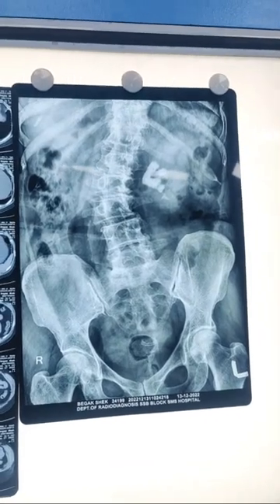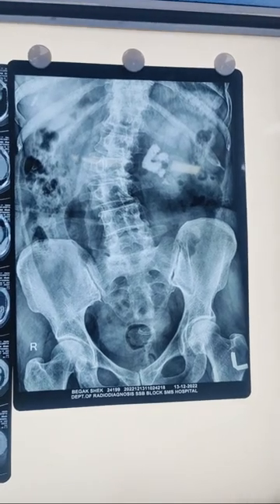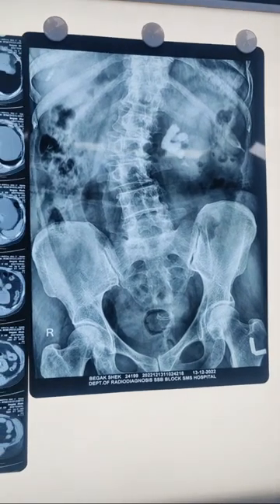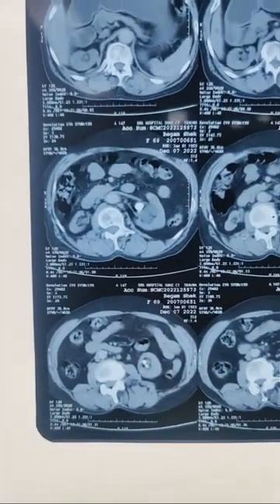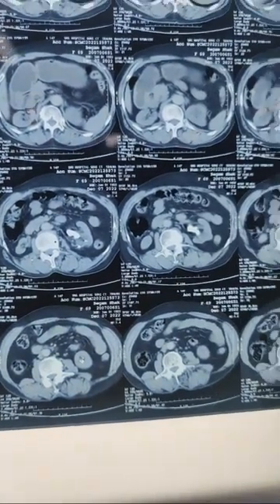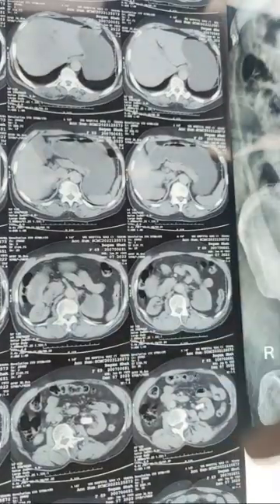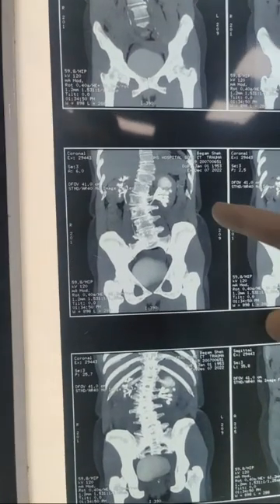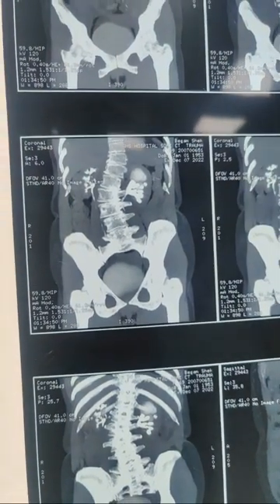So this is the x-ray of this patient. She is a little scoliotic, and she has a staghorn stone in the left kidney. If you can see the CT films also, just show the CT films. The upper calyx is dilated and all the rest of the calyces are filled with stones. This is the dilated calyx here, the upper calyx. So here you can see the whole kidney is filled with stones almost. Only the upper calyx is dilated.